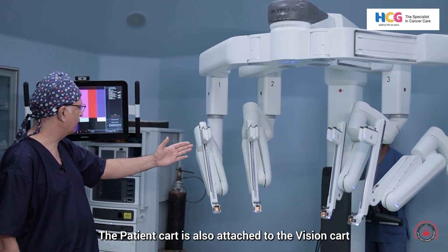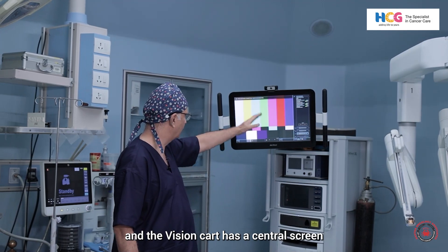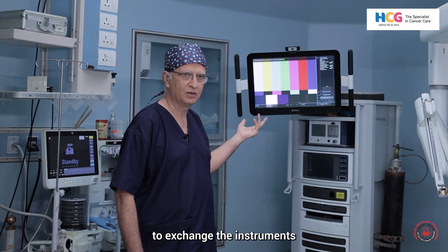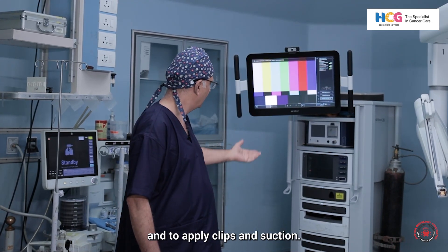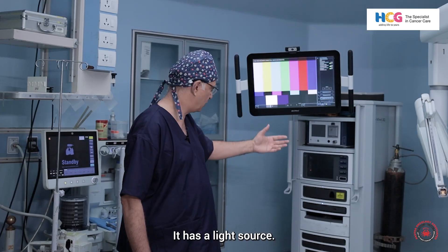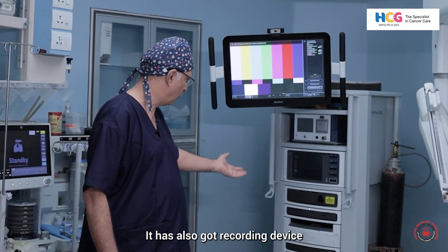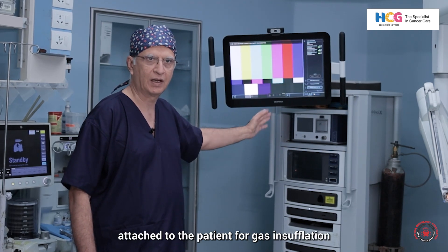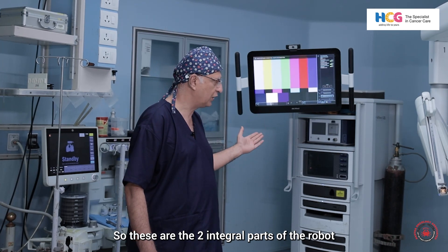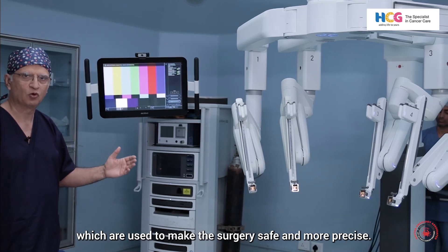The patient cart is also attached to the vision cart, and the vision cart has a central screen which is used by the bedside assistant surgeon to exchange instruments and to apply clips and suction. It has a central electrosurgical unit and a light source to transmit light inside the patient. It also has a recording device and an insufflating device for gas insufflation inside the abdomen of the patient. These are the two integral parts of the robot which are used to make the surgery safe and more precise.